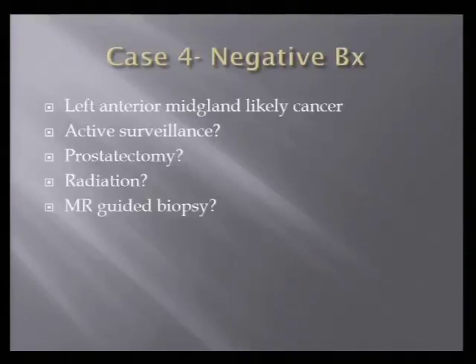That'd be hard to biopsy. Do you want to get an MR-guided biopsy? Very few institutions are actually doing MR-guided biopsies. Where I was at, they were not doing them. I've never even seen one done. I don't even think at the University of Iowa they're doing them right now.